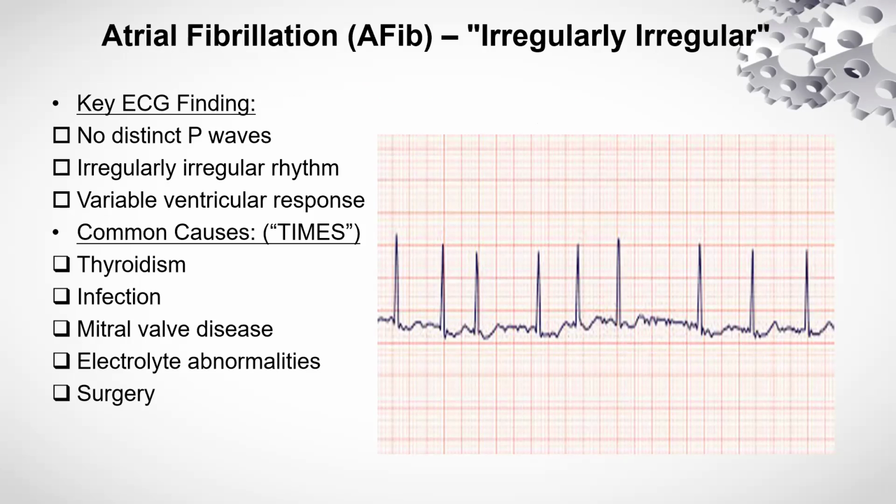Okay, somebody can see a P wave? I don't want to touch again. I think my touching it is moving up and down. So number 2, look at the RR interval. They are not regular, isn't it? The RR interval is not regular, so it's irregular, all right? And we have variable ventricular response. So when you are given this ECG tracing, your spot diagnosis is that this is atrial fibrillation.